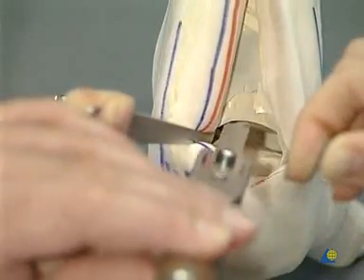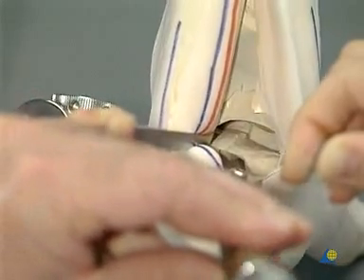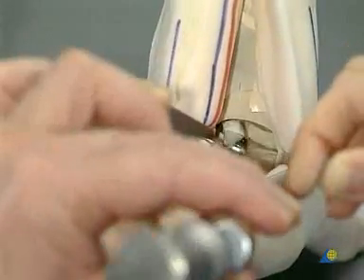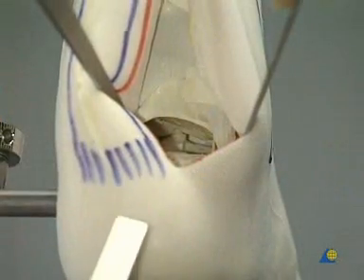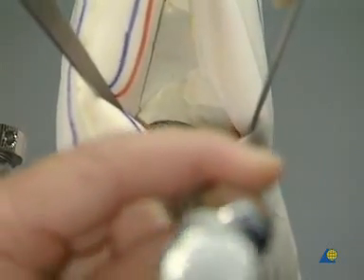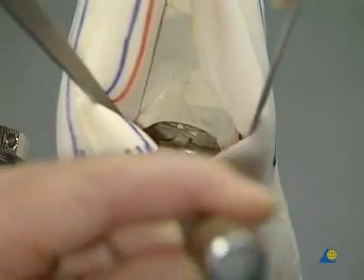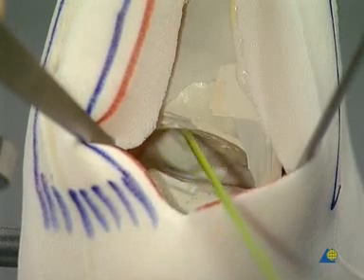Using a chisel or an osteotome, bony and cartilaginous debridement is performed on the calcaneus. Debridement is also carried out on the talus. All osteophytes and scar tissue must be removed.